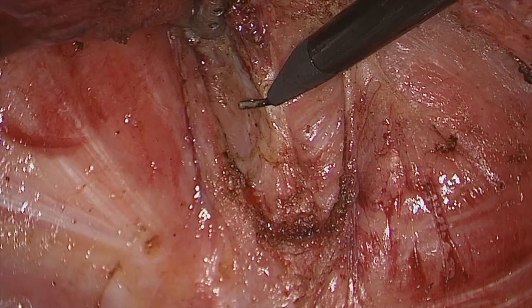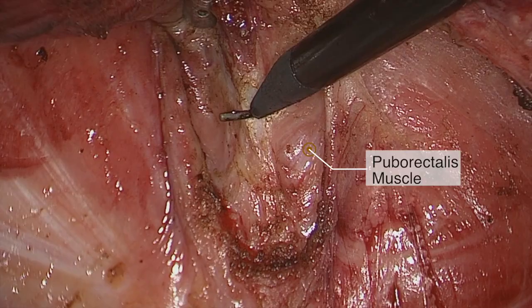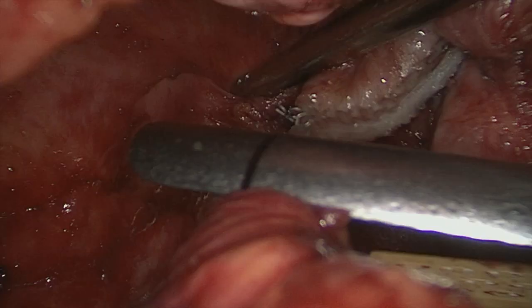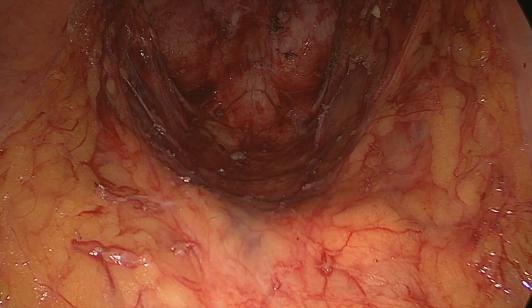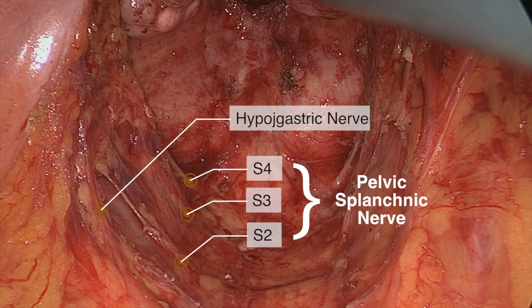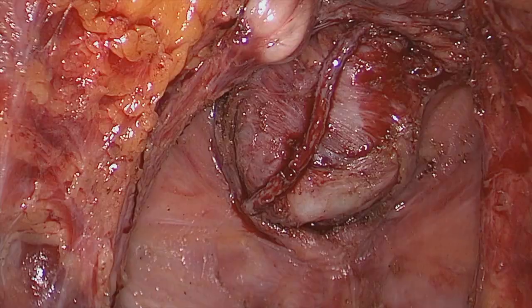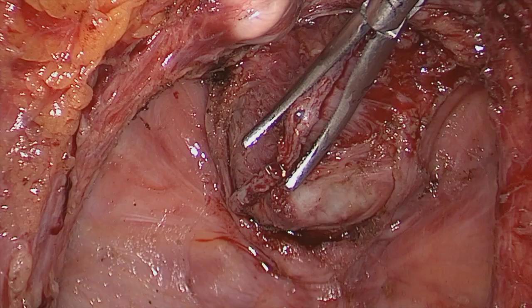Careful not to injure the hiatal ligament and the puborectalis muscle. An endoscopic linear stapler is now introduced to transect the rectum. And lastly, double stapled anastomosis.